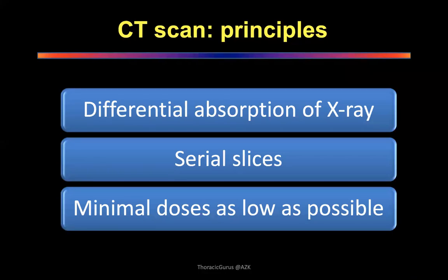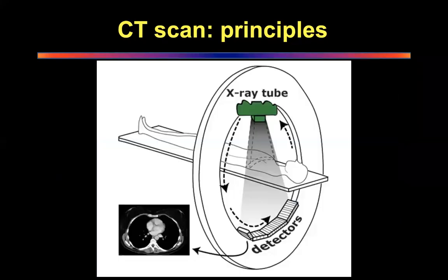This is just a basic background. I'm just preparing you for understanding how a CT scan works. So this is how a patient lies. And this is an X-ray tube, which is shooting the X-rays across here. And there is a detector on the opposite side. And this goes around in an anti-clockwise direction and takes films from all sides so that all these images are then superimposed and recomposed as a single image, okay?